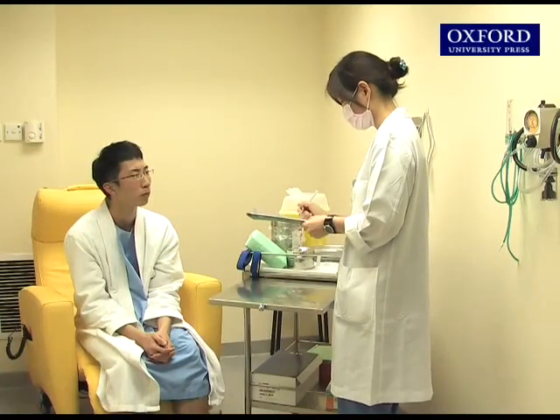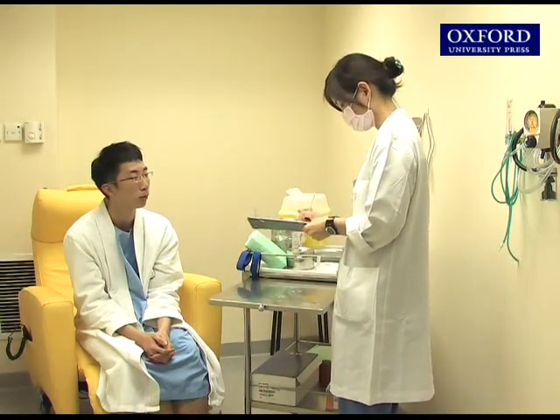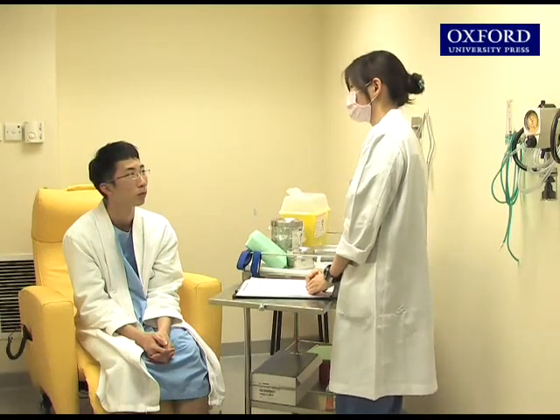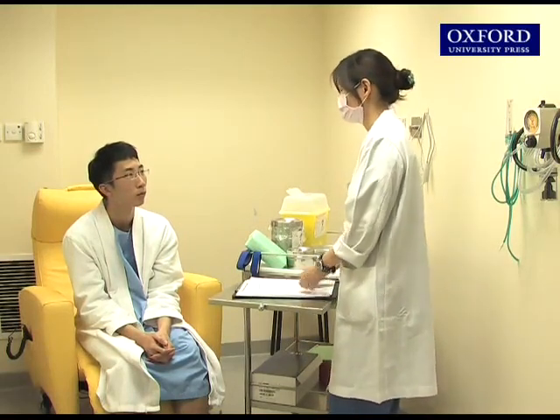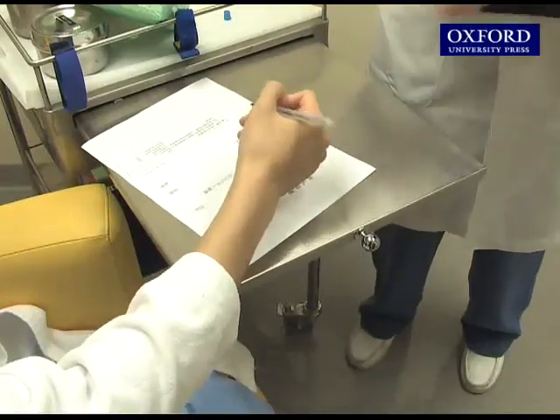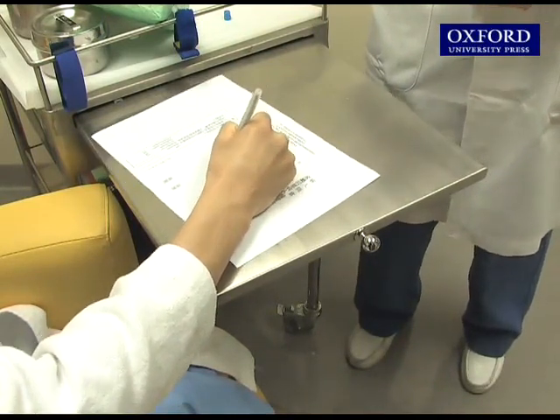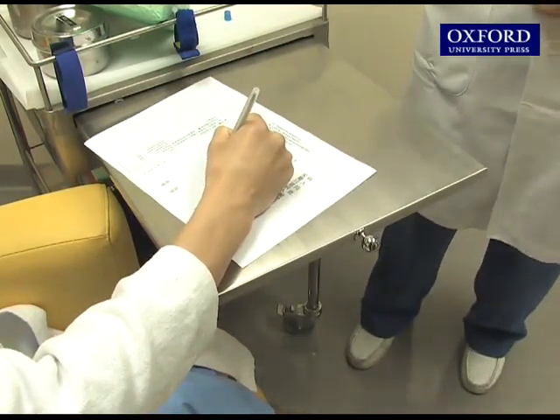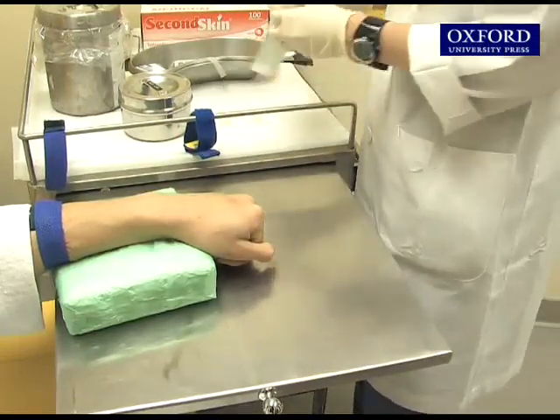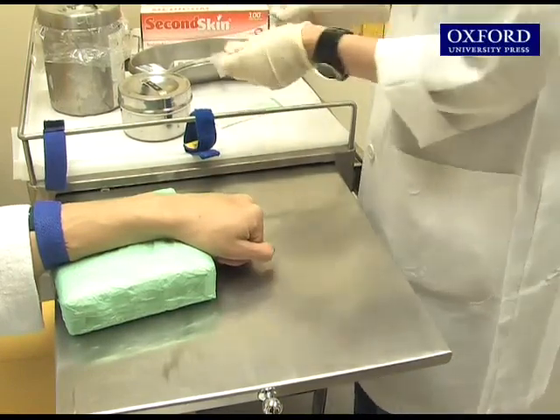Before the radionuclide imaging examination, the nurse will verify the patient's identity, confirm his or her health situation, and explain the risks and the process of the examination. The patient must sign a letter of consent before taking the examination. The nurse will insert a needle in a vein on the patient for later injection of radioisotope tracer.